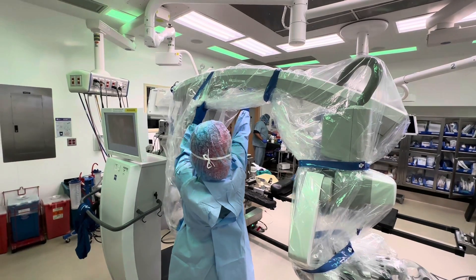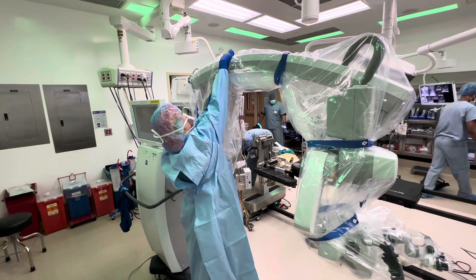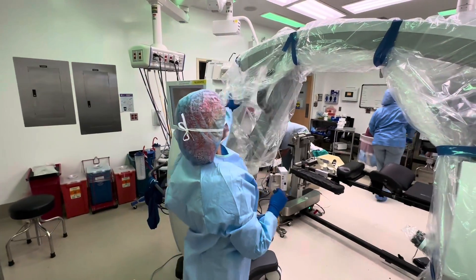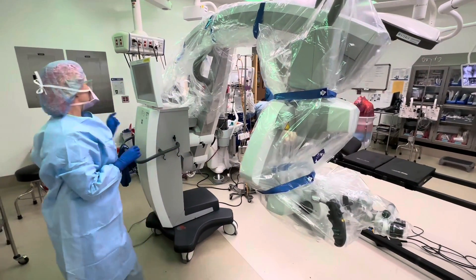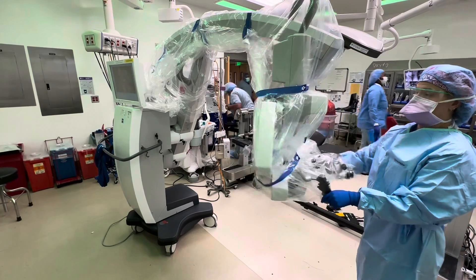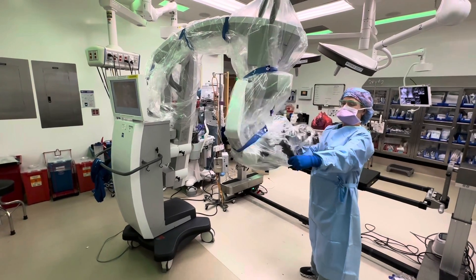The last portion — the circulator does the last portion because it's all sterile. Then do the vacuum. Make sure everything is all the way around and nothing is in the way.